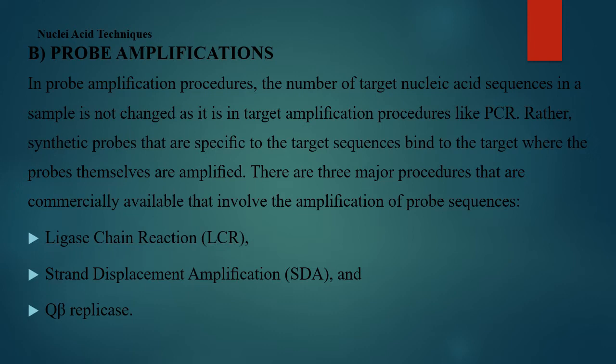There are three major procedures that are commercially available for probe amplification. We have the ligase chain reaction, LCR. We have the strand displacement amplification, SDA. This is not your regular SDA. And then you have your Q beta replicase. So these are the three kinds of probe amplifications we want to look at.